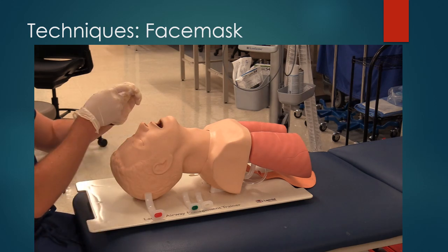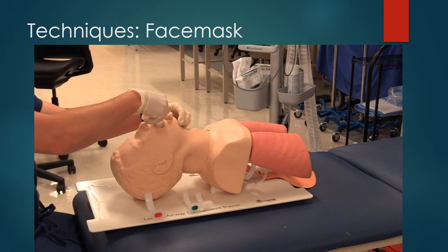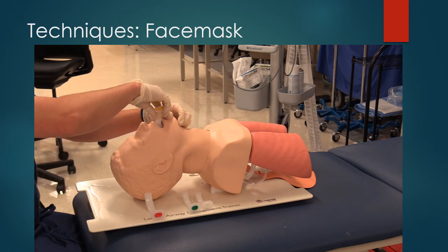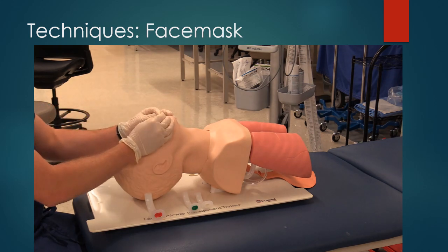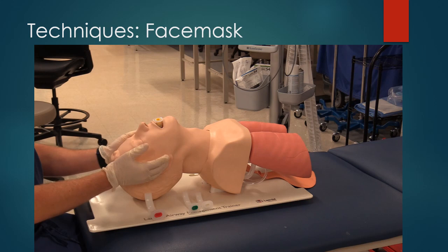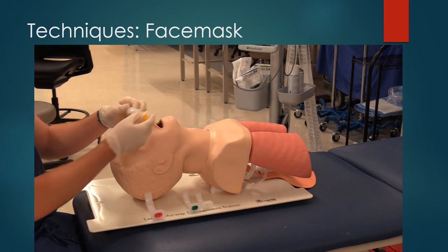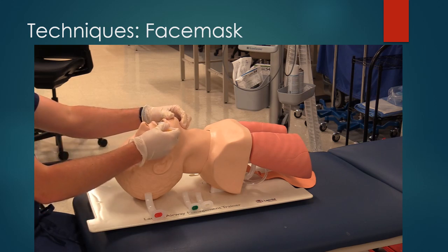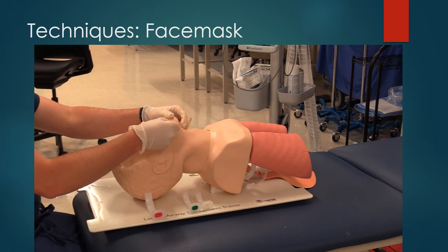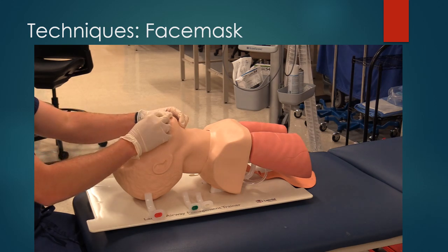You can do it where it's 180 degrees, slowly insert until feeling pressure on the hard palate, and then rotate while advancing. If this is unsuccessful, one of the other options is to start with a 90-degree angle, inserting until, again, you feel resistance, and then rotating to allow for it to end up in that final position.